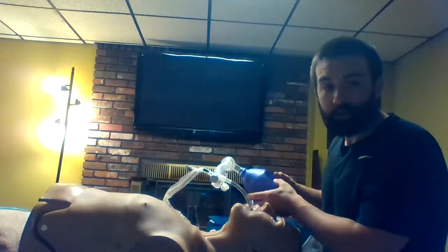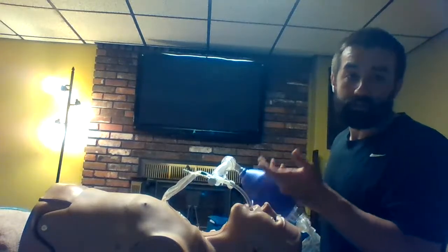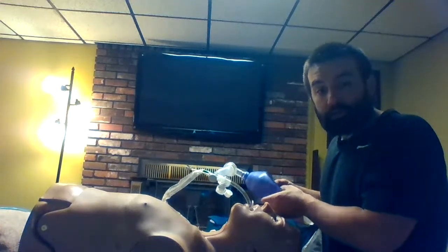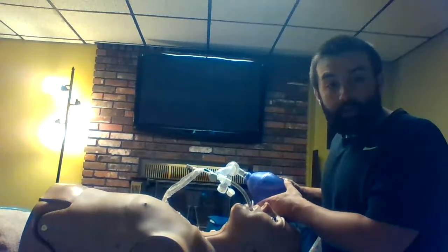I'm looking at the patient. I don't have any chest rise. On a real patient, you'd probably have a leaky sound or loud gurgling noise. It's hard to describe, but as soon as you hear it, you'll know exactly what it is. You'll hear air coming out during inspiration, whether that's a breath from the ventilator or a breath from my ambu bag or anything like that. You'll hear that loud leak.